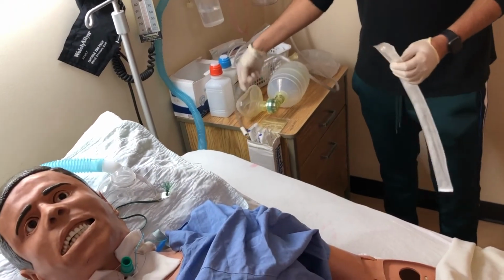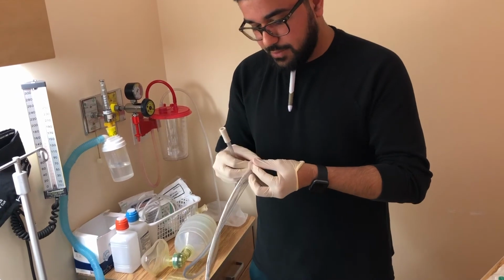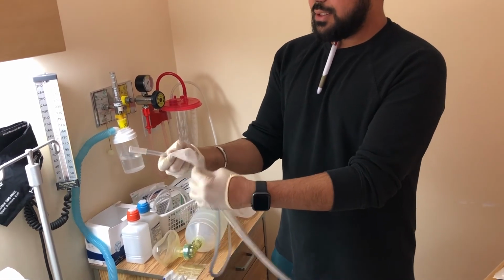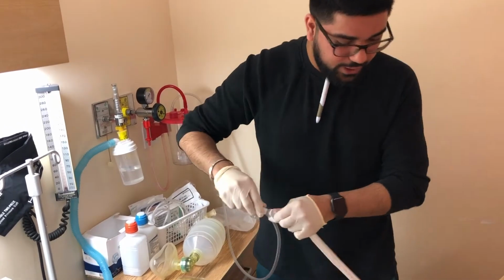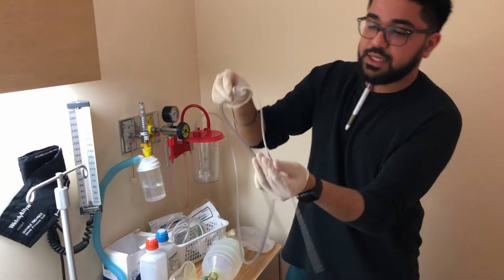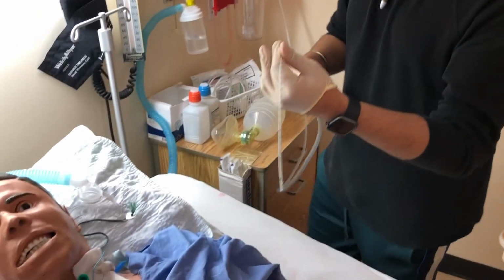What we can do at this part here is use sterile technique to attach the catheter. So we can open this guy up. Open this guy up in a butterfly form. Attach our tubing. And what we can do now is pull this out. You want to maintain at least 4 to 5 inches of sterility. So everything underneath this part right here would be not sterile. Everything above is sterile. You don't want to suction while you're going into the patient.